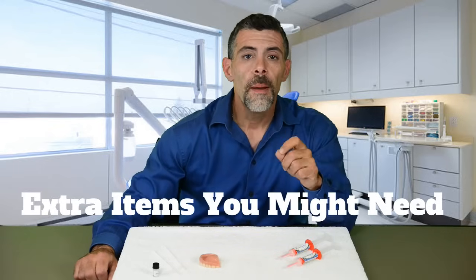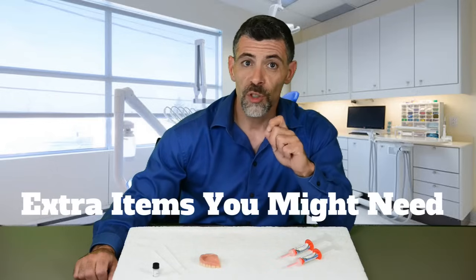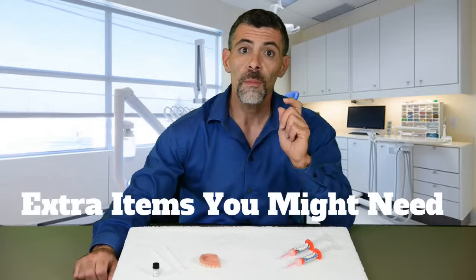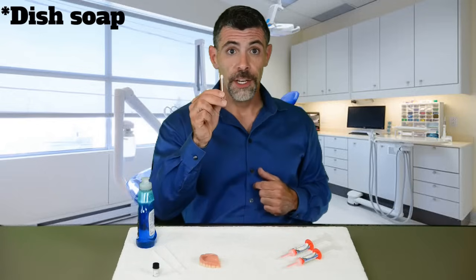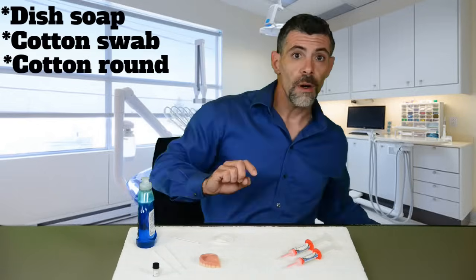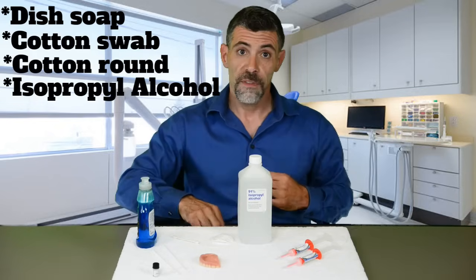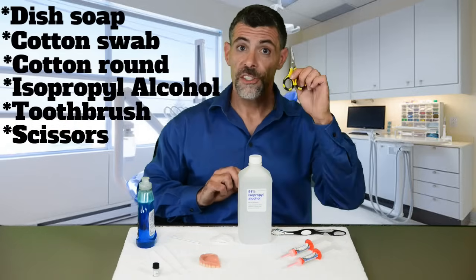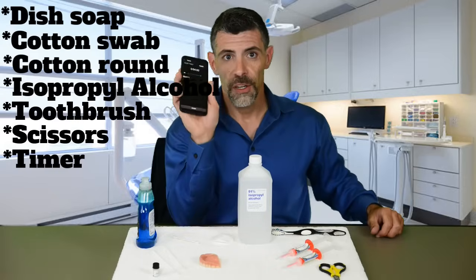It's time to talk about cleaning, rinsing, and drying your denture. But first, let's talk about a few extra items we suggest you have on hand: number one, dish soap without moisturizer; number two, cotton Q-tip; number three, a cotton round; number four, isopropyl or rubbing alcohol; number five, soft bristle toothbrush; number six, scissors; and number seven, your timer.